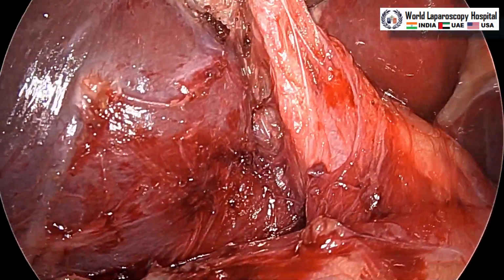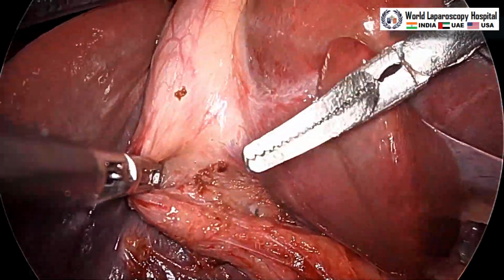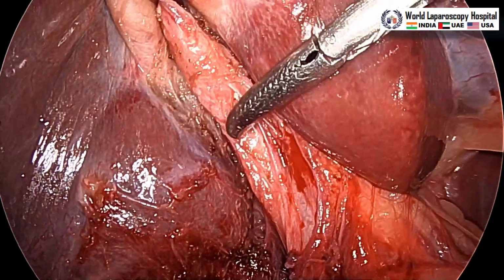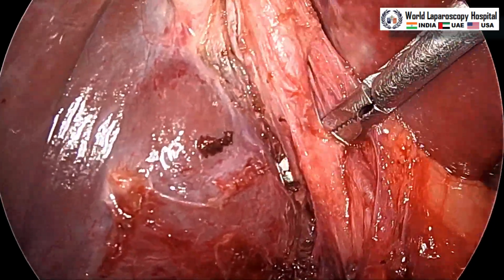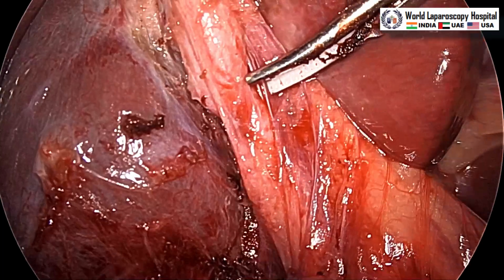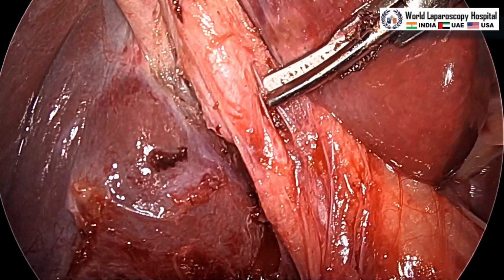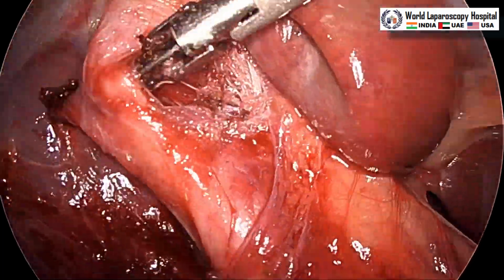Now, this Maryland will be introduced to make the posterior window, and it is in between the liver and the cystic artery. After that, this is the anterior window. You can separate the artery from the duct by Maryland. And here is the anterior window in between the artery and duct. These are fibrous trabeculae which you can separate to skeletonize properly the artery and duct. This is important, that when you make this window, you should take care that the vibrating jaw of the harmonic should not directly touch the artery or the duct, and this is the anterior window.